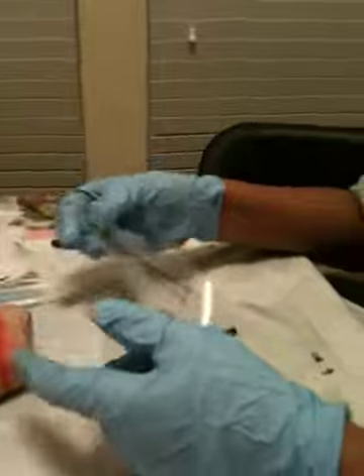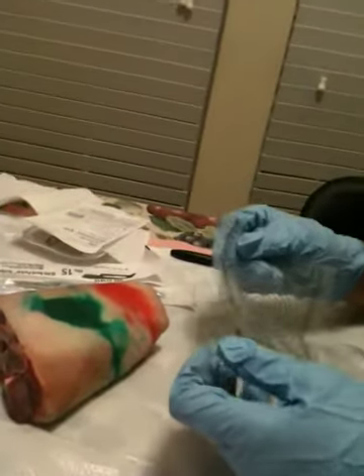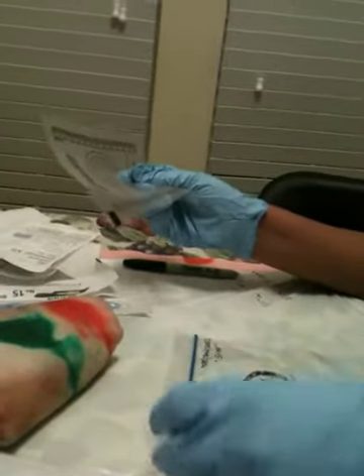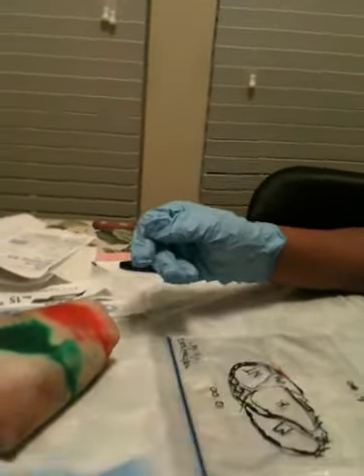Between the two readings there is a discrepancy, and in clinical practice I would probably measure the wound on the patient and have that standardized throughout the patient's stay. Or, depending on the policy, if they prefer the tracing, then I will do this and photocopy it and save it in the patient chart. Okay, so this is the tracing again with all the details.